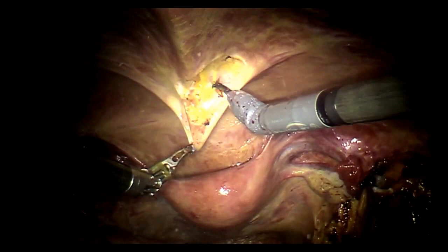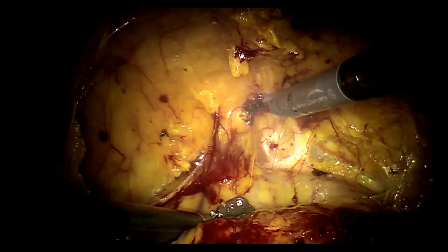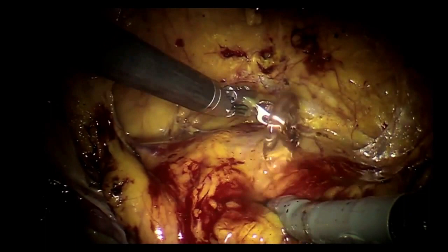Would you consider doing this operation laparoscopically also? I don't think so. We thought of doing kidney transplants laparoscopically a long time ago, but never really got excited about it. Wow, how about that? Really thin.